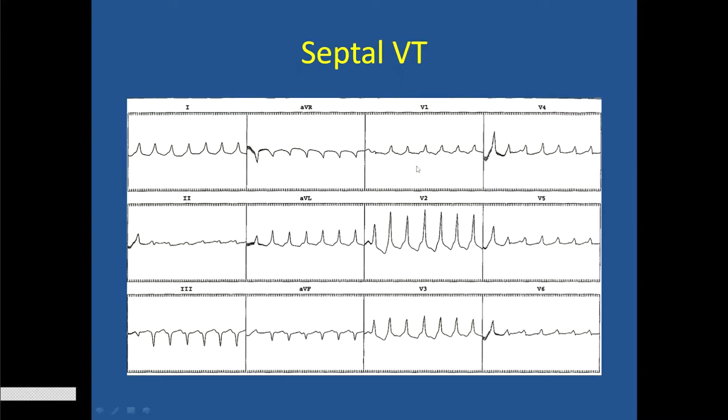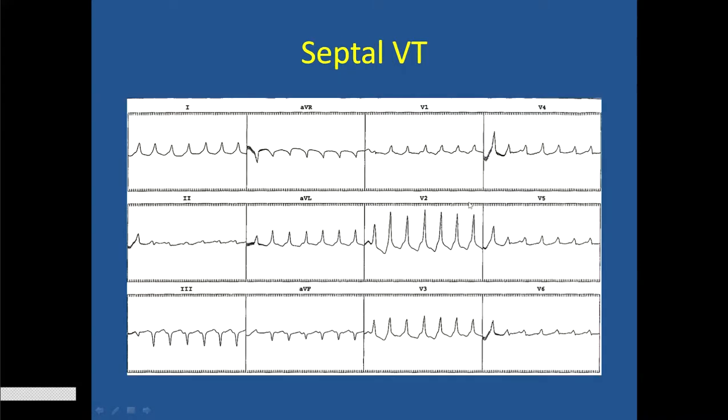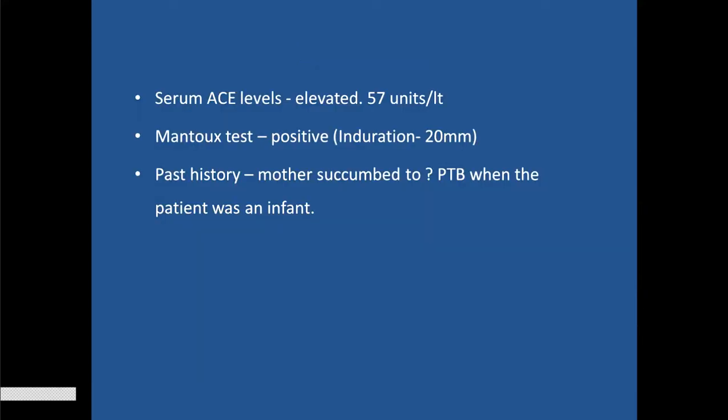The problem with this is, you see these septal scars, these patients can present with very narrow QRS, and this can be a septal VT which can be misdiagnosed as a supraventricular tachycardia. So it is very important for EP specialists to be involved and to study it further.